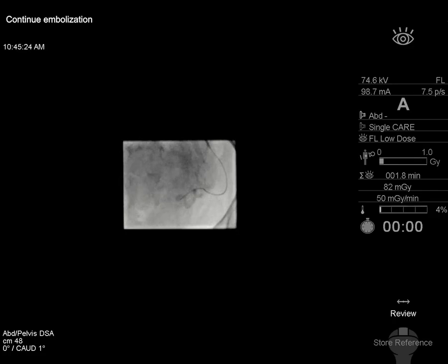They've collimated quite tightly and are starting to embolize with little puffs of contrast, and between those puffs you can assess how quickly the contrast is flowing back away from the catheter, also looking for reflux of contrast alongside the catheter, and as well as tissue staining to assess the endpoint in embolization.